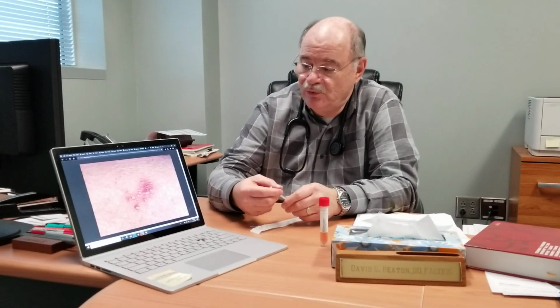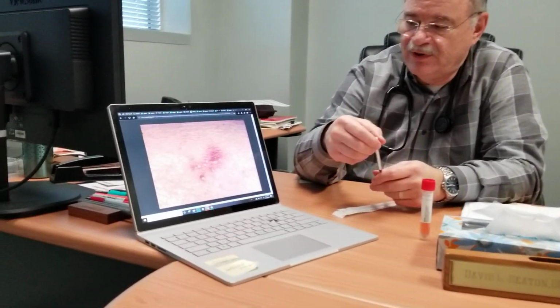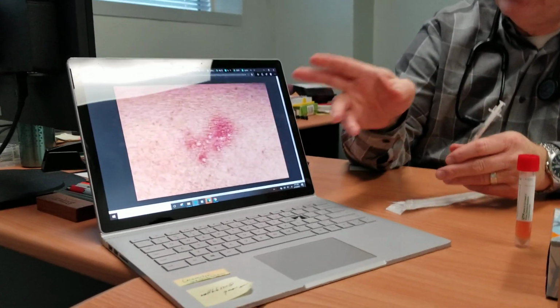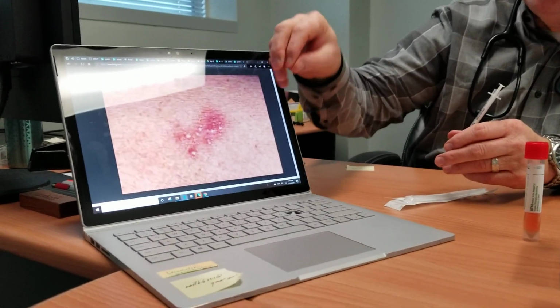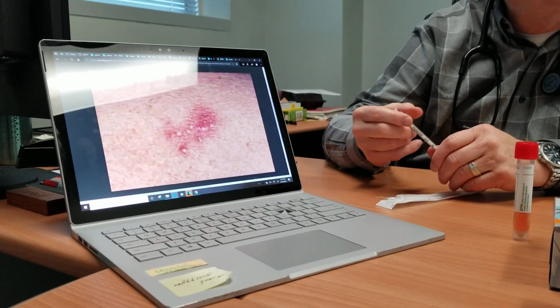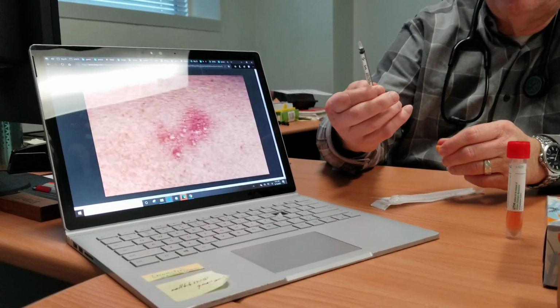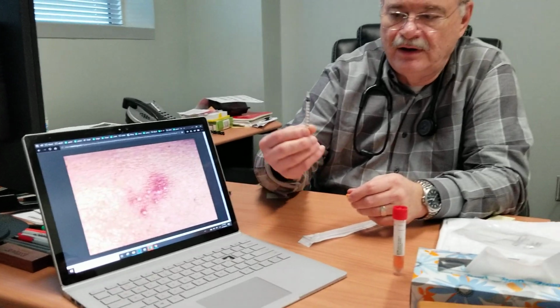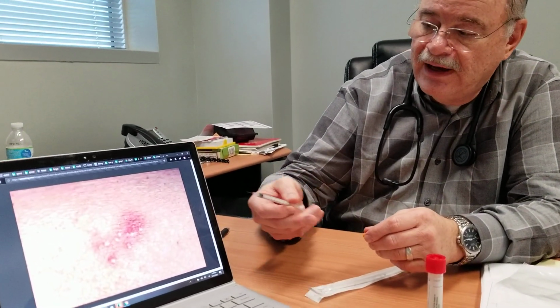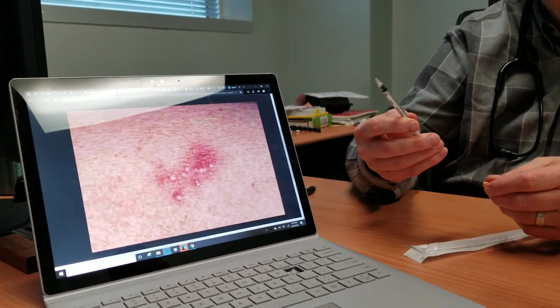So basically what you want is, say you've got vesicles that are present, the fluid that is present in the vesicle is teeming with viral particles. So you want that fluid collected. Well, if you rub it, it's going to rupture, and then some of it may get on the swab, but you might miss some of it. Actually, by using a small syringe, like a tuberculin syringe or an insulin syringe, it's barely noticeable, even on a tender spot, to actually infiltrate the vesicle and suck the fluid out, and that's teeming with virus.